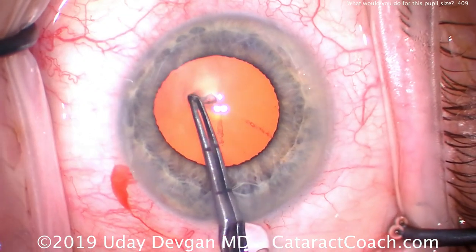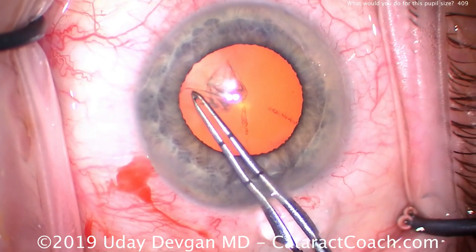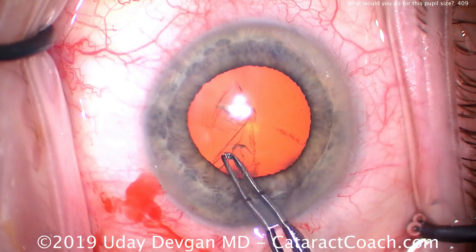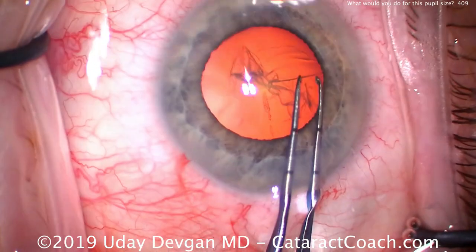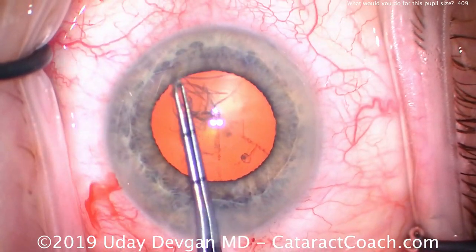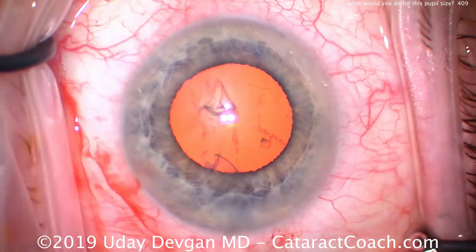In fact, we don't even need to stretch the pupil. We'll make a sufficiently large capsulorhexis — we want about a five-and-a-half millimeter rhexis. Look carefully: the rhexis edge is under the iris. We're able to go around 360 degrees, and the entire time we're making the rhexis a little bit bigger than the dilation, so the pupil is a little smaller.